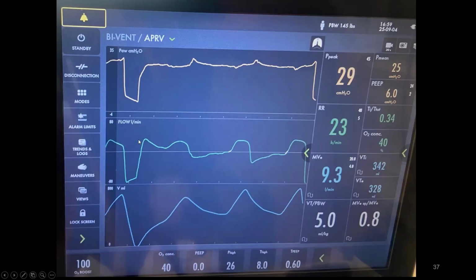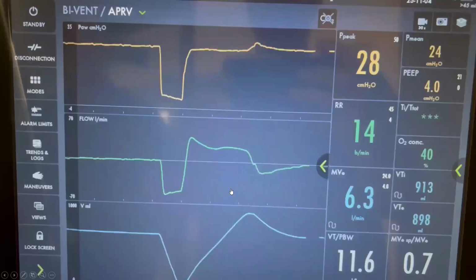And that's the key to look at, because believe it or not, your minute ventilation is going to go up, but you'll also see tidal volume go up. And everyone always asks that. It's like, I went out on numbers and down on pressures, so why did my tidal volumes go up? And again, you're allowing that patient now to breathe on top of FRC. If you're over distending, you're not going to be able to see that. So you have to watch that and make sure that that lung is staying compliant there.